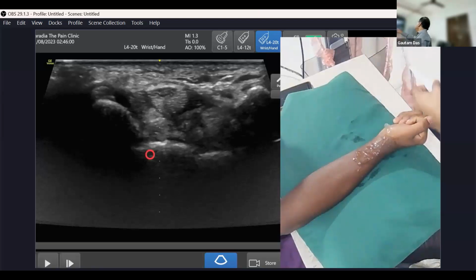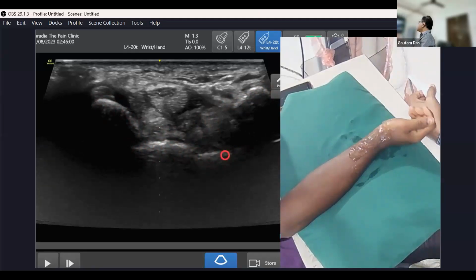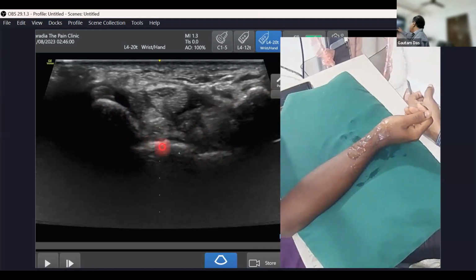Okay. So this was your pisiform, this was your scaphoid. What is that bone? Lunate has ended. So what will be this zone? This is your capitate. This is your hamate. So the floor of the carpal tunnel is formed by capitate and hamate. Remember the capitate and hamate.